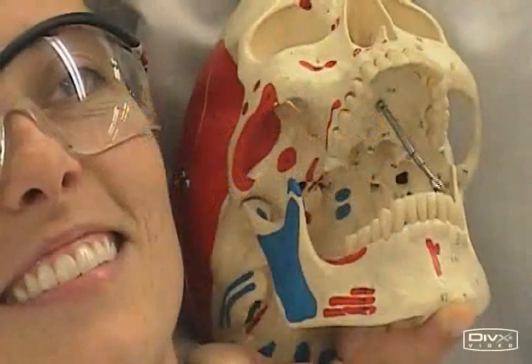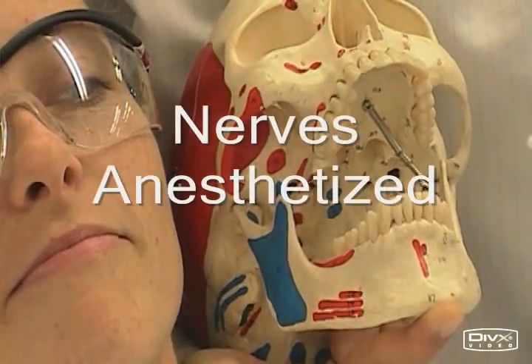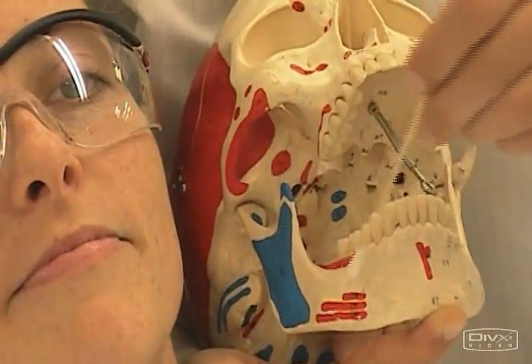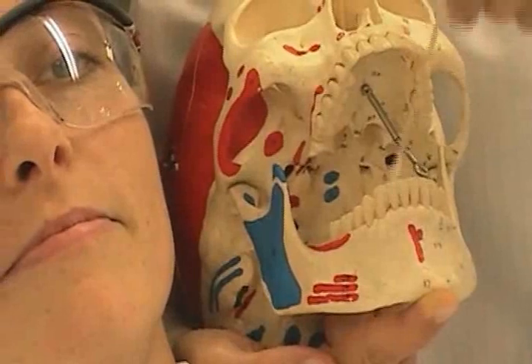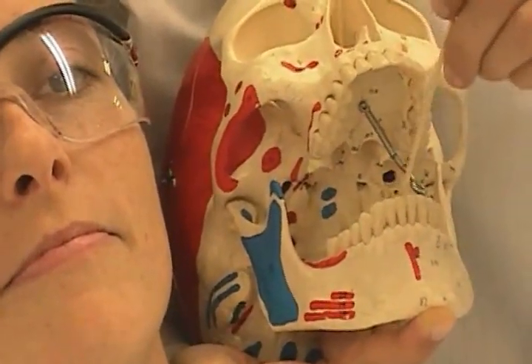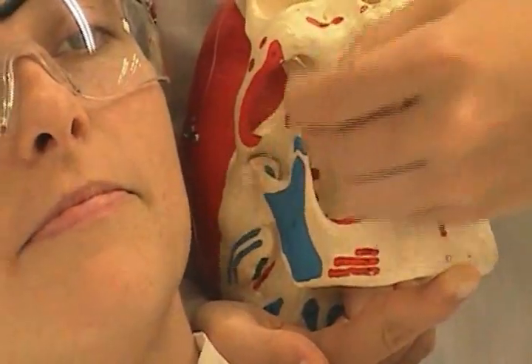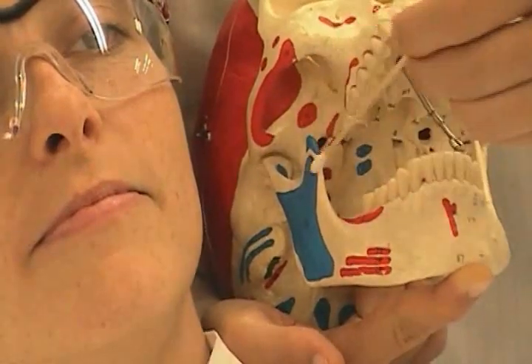Today we're doing the Gow-Gates Nerve Block Technique. The nerves anesthetized are the inferior alveolar, mental, incisive, lingual, mylohyoid, auriculo-temporal, and the buccal in 75% of patients.